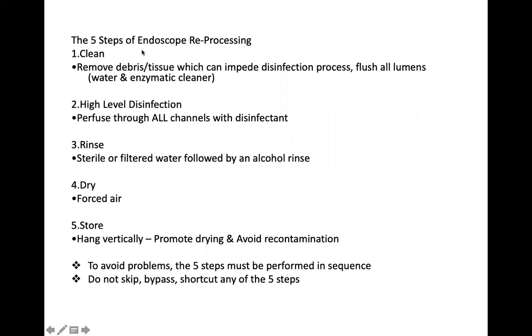A patient may be concerned that you're using something that was used by another patient previously. And yes, you can show them, or the infection control team can have this as their SOP, which you need to follow stepwise. You do not bypass any step when you're reprocessing a medical item.